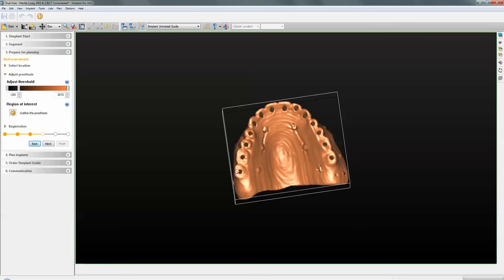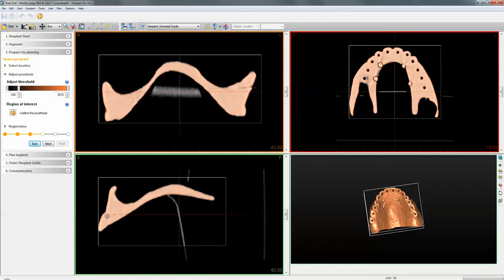This is an old stent shown here. You do not need to have screw channels drilled onto the stent itself. Just use the patient's existing dentures — the prosthetic envelope that provides is more than good enough information to continue with the planning.